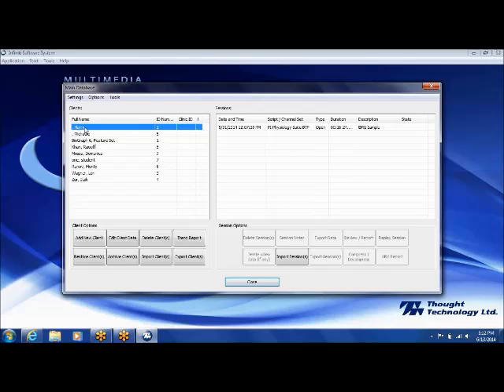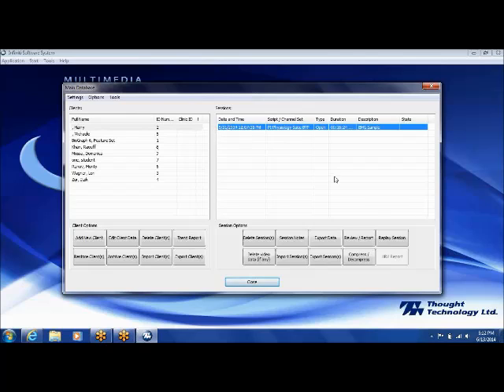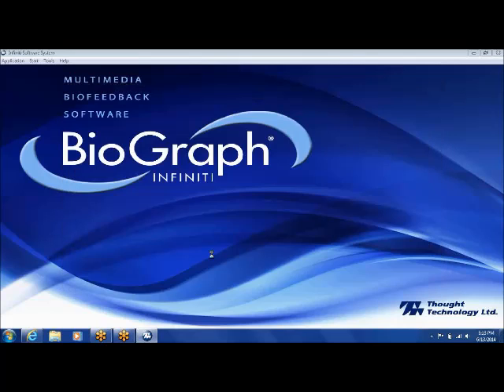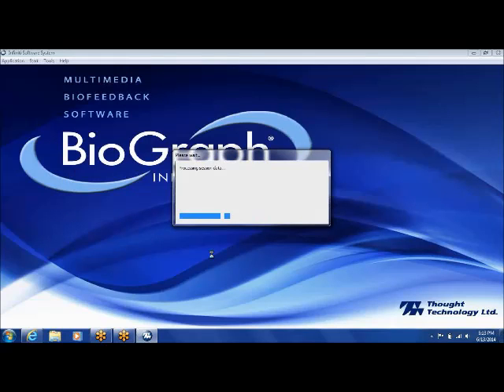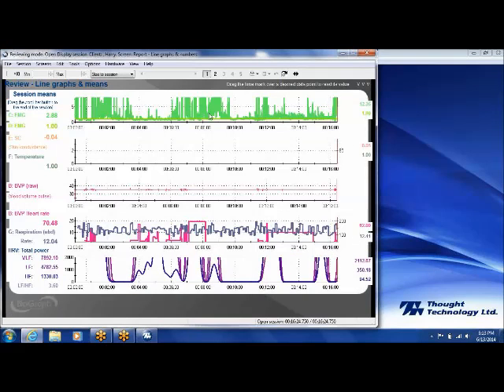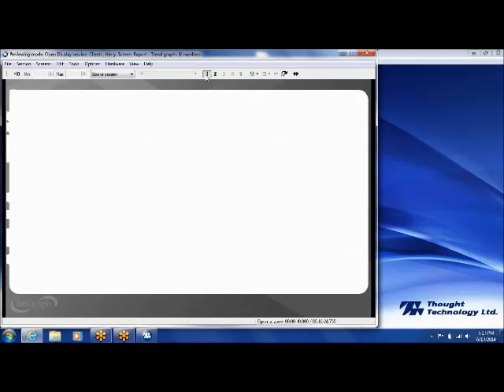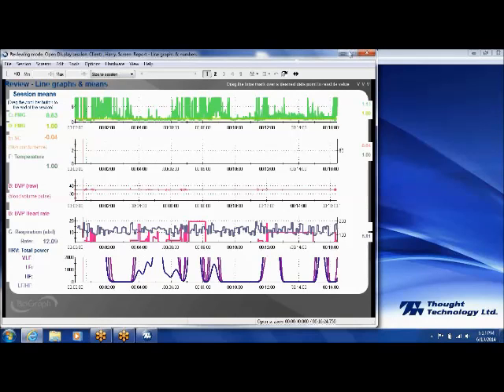I'm going to select a session that I ran with myself. I select my name, then on the right side of the screen I select the date and time. Now I can do a couple of things. One, I can do review report and look at the results of the session. I select the screen, click OK, and it gives me a graph once it reads in the data — showing a summary graph of what was recorded. I can see a summary of that session in that way.